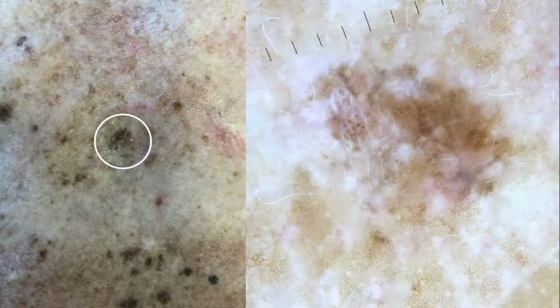And this atypical lesion that happens to have prominent skin markings, of course, not super specific for melanoma, but in this case, a suspicious lesion indeed. But if we're going to suspect that this is a melanoma, we want to guess melanoma in situ, and this was in fact the case. And here we have another flat lesion on chronically sun-damaged skin with widespread regression covering at least 50% of the lesion, also indicating melanoma in situ.